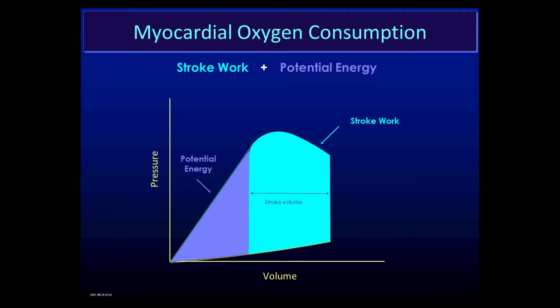I also want to talk a little bit about myocardial oxygen consumption, and to remind you that this is the area under the combination of two curves, the curve of stroke work and also the curve of potential energy. Remember, your heart doesn't fill to total empty, so there's a potential energy in order to get to that initial volume, and the area inside this entire curve equals myocardial oxygen consumption. We'll talk about what the rotodynamic pumps do.